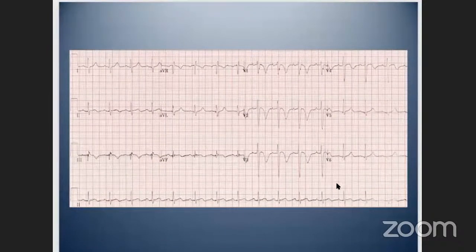Okay, for the sake of time, Shiraz, this is exactly a similar case. This is a 37-year-old female on oral contraception, and she had a travel history. And here, on this ECG, we can see, very similar to the previous one, that you have your delayed intraventricular conduction with your widespread right-sided strain pattern. And so looking very similar to the previous one, but if we take our rule of fours as we build our history into ECG interpretation, we can see that this is strongly suggestive of a PE.